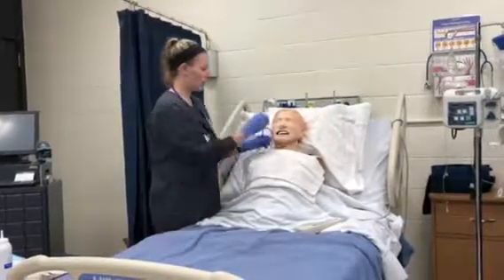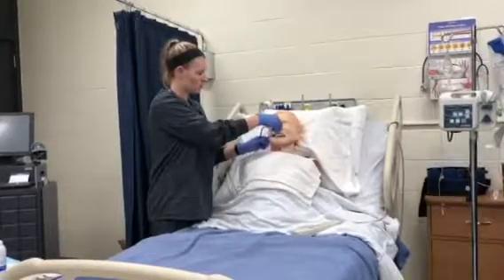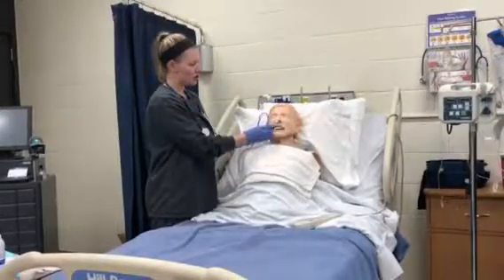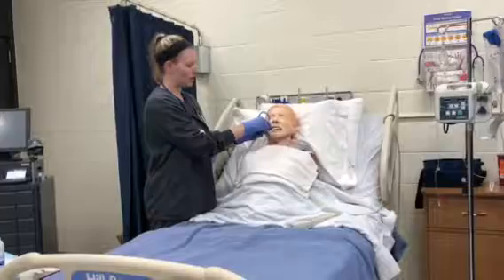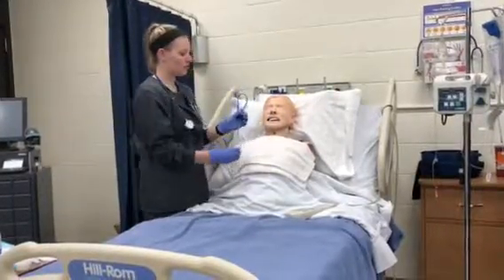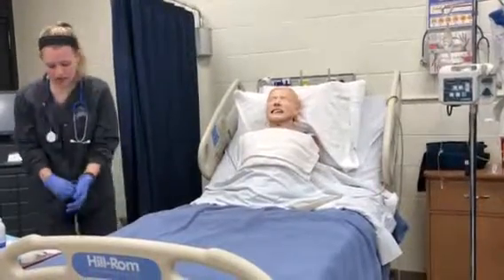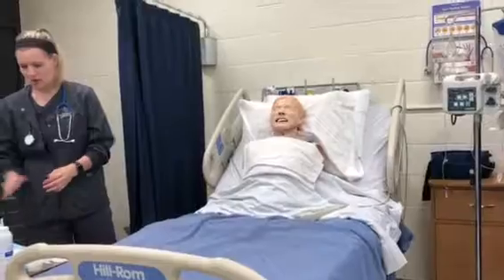So then I can undo my tape. I'm going to pinch the tubing so that nothing comes back out at me. I'm going to tell the patient to take a deep breath, and I'm going to pull it out real quick and wrap it up in my hand. I'm going to throw it away in the trash can, take off my gloves, wash my hands, and document everything I've just done.